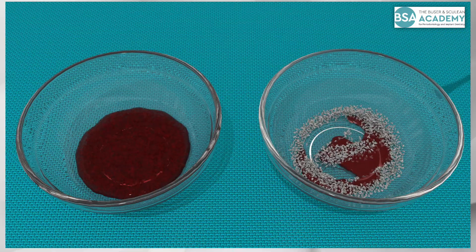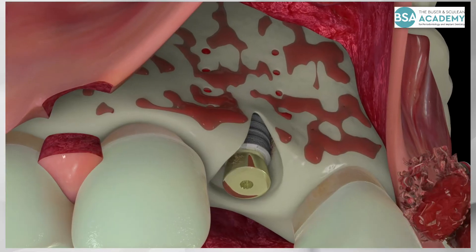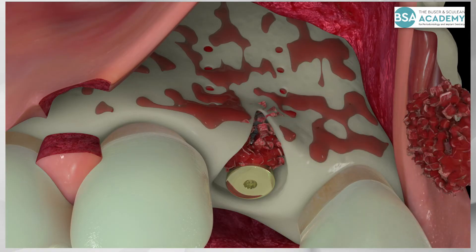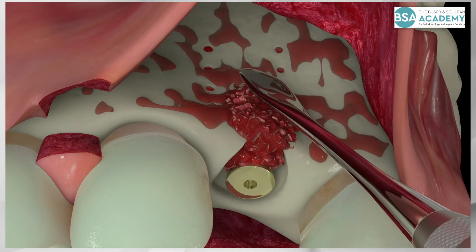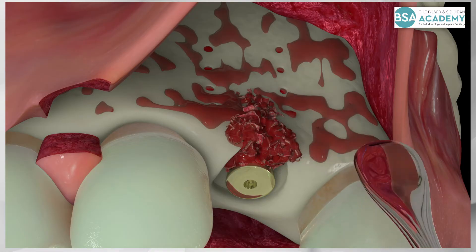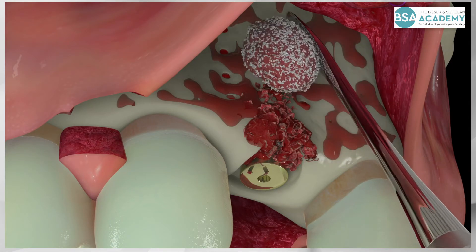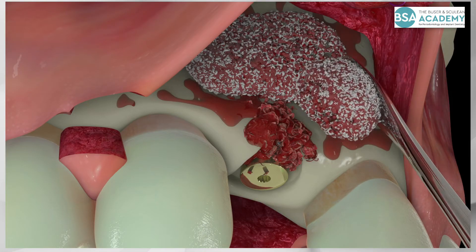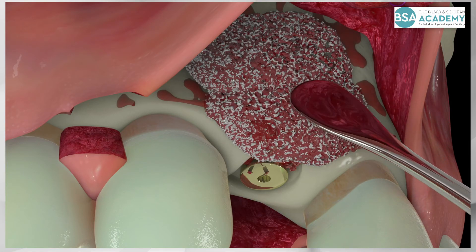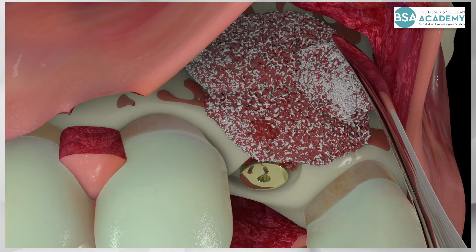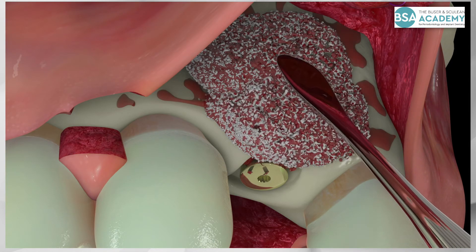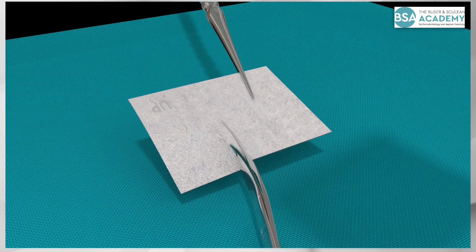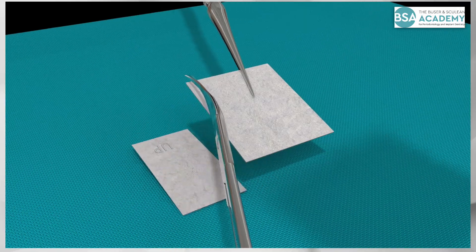Bone augmentation is initiated with the application of the autologous bone chips. The first layer of bone chips is applied to the rim of the healing cap and completely fills the facial bone defect. The second layer of bovine bone particles is used to over-contour the local ridge anatomy. The surgical technique is called contour augmentation, using two synergistic bone fillers: autologous bone chips and bovine bone particles.